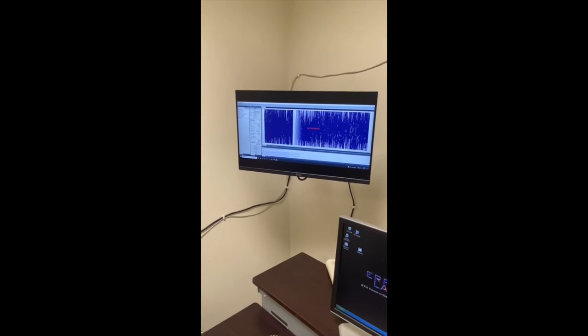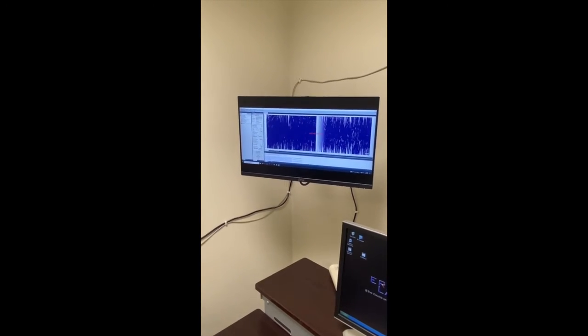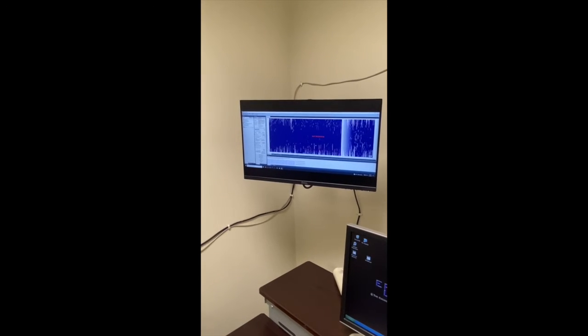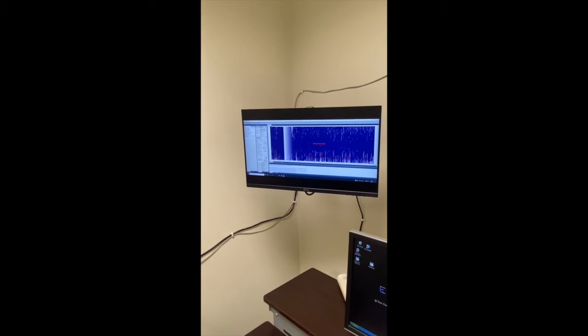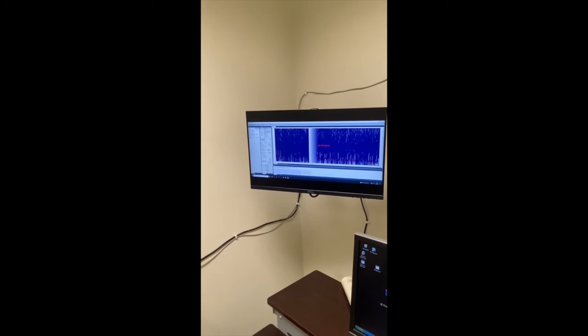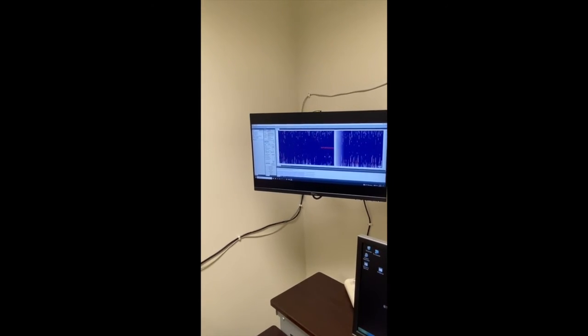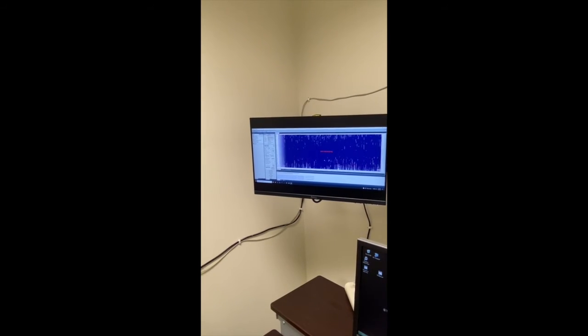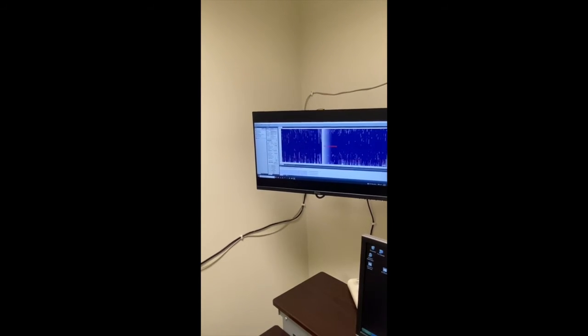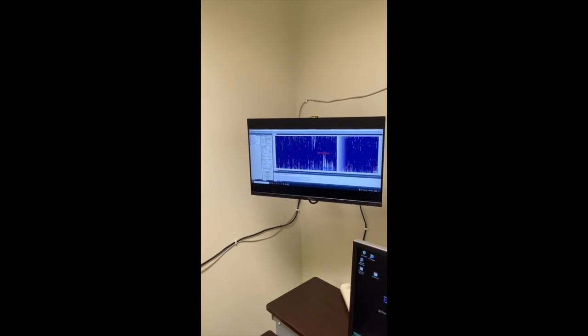You can then explain to them what ERPs are. ERPs, also known as event-related potentials, are electroencephalogram data, the data on the graph you just showed them, that is time-locked to an event such as a word, sound, or image. Make sure to note that it's a non-invasive technique used in cognitive neuroscience and simply allows researchers to measure the brain's response to such events, and tells us how certain types of information are processed.